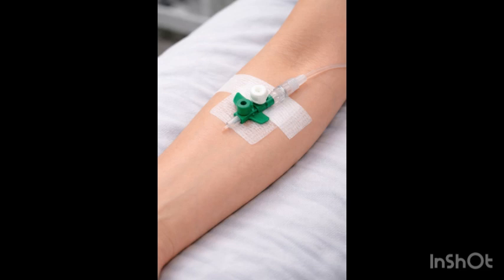When you're placing the cannula, try to use the smallest size of cannula needed, and try to use the most distal vein. If the patient is for usual antibiotics and IV fluid, you don't need large cannulas. But if the patient comes with an RTA, sudden accident, or sudden collapse, which needs much more blood supply and much more IV fluid, in that case you can consider putting in a large cannula.